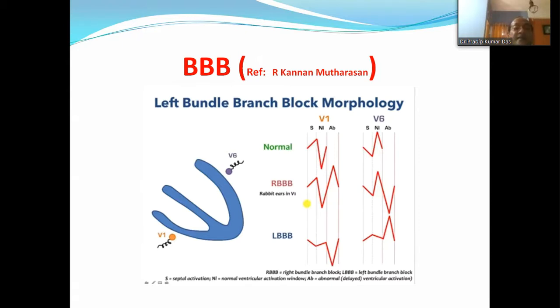Then after left ventricular activation there will be right ventricular activation, and the right-sided lead will see an upright deflection, and the left-sided lead will see a downward deflection.